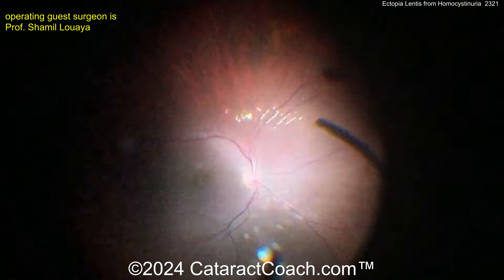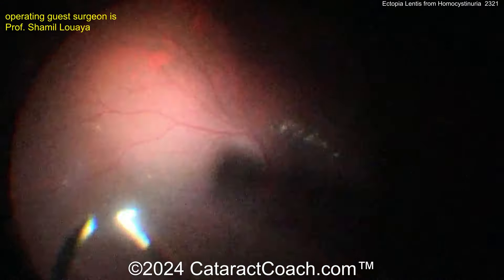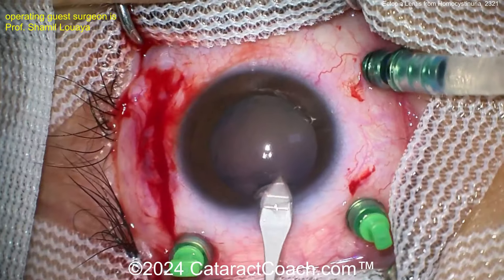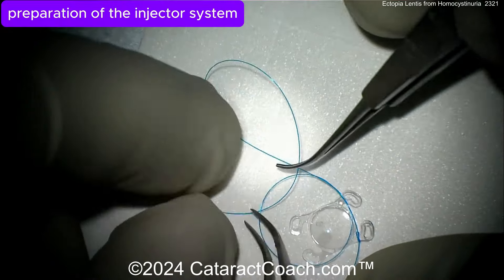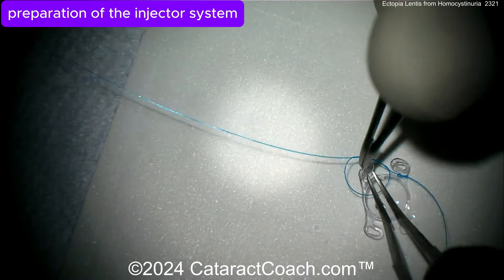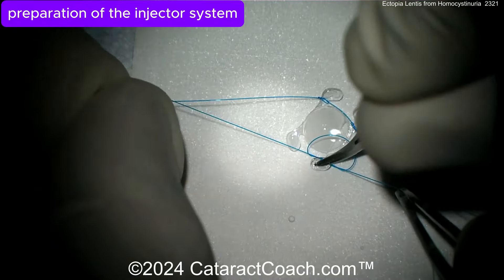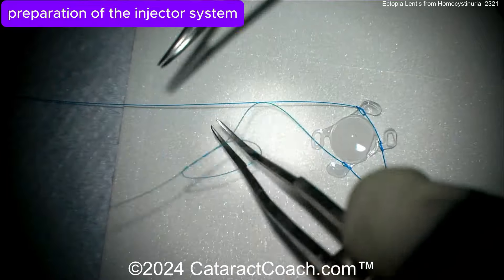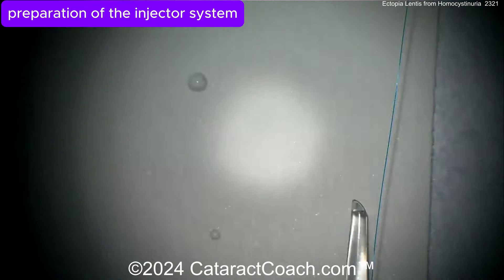Now cleaning up all that vitreous, we need to figure out how to fixate a lens in this eye. Our guest surgeon has an unusual technique I've actually never seen before — when I watched this video I said, 'Wait, show me that again.' This lens has four eyelets, but the surgeon is not using them. Instead, a loop of prolene suture is placed around each of the haptics — very interesting.